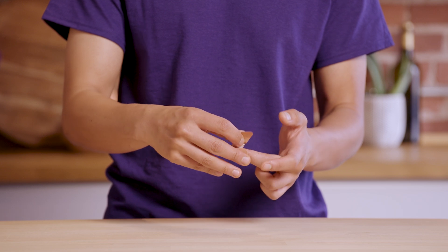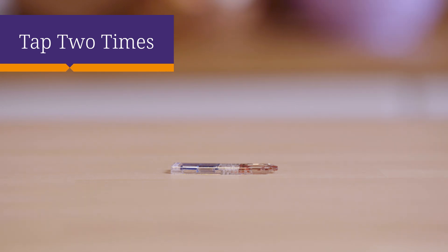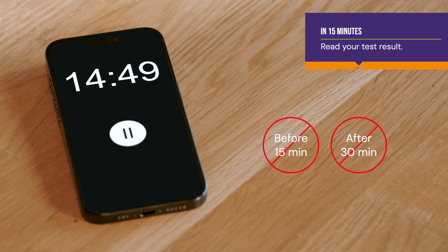Quickly put on the adhesive bandage provided. After filling the test, tap the opposite end of the test twice on a hard surface. This ensures the blood flows onto the test strip. Then lay the test down on a flat surface. Set a timer for 15 minutes before reading the results. Do not read the results after 30 minutes. An incorrect result may be obtained if the test is read before 15 minutes or after 30 minutes have passed.